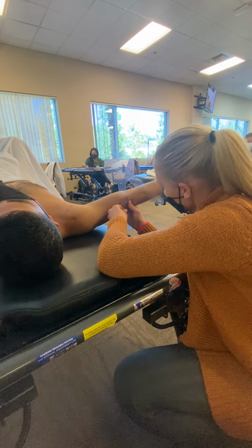Does that make sense to everyone? How you can do both ways to measure it. Mm-hmm. So that's the clavicular. For sternal portion, you're going to bring him up to about 130. Does it say 130 or 160?